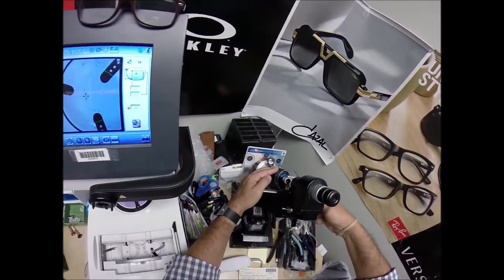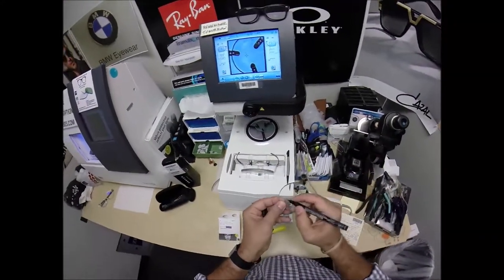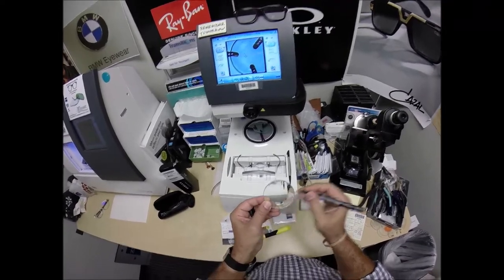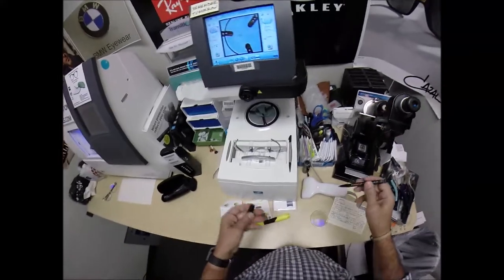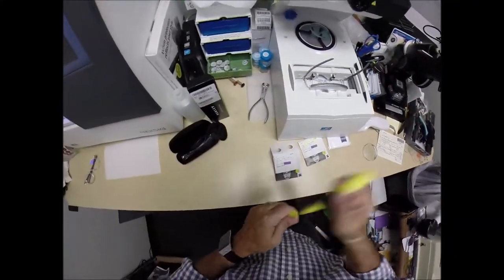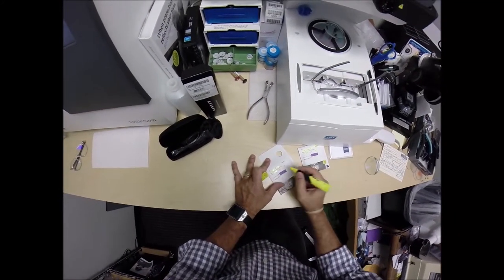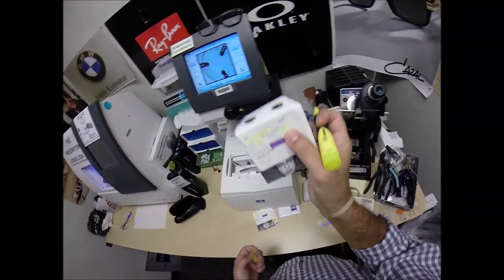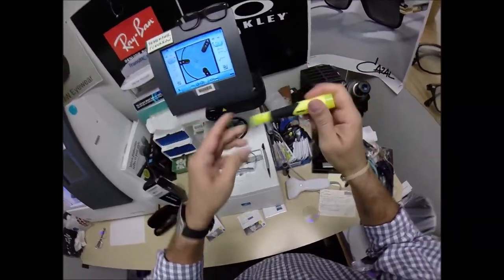Put three dots on those lenses. Let me darken those so you can play along at home. 1, 2, 7. I mathed wrong again. Put an L on here. If you guys missed any of that, well, you just have to hit rewind. Okay, so I'm going to write on here, minus 6, minus 50, at 75, DuraVision Blue Protect. It says F67, it is the 167 high index. And again, if you guys missed any of that, let me recap.